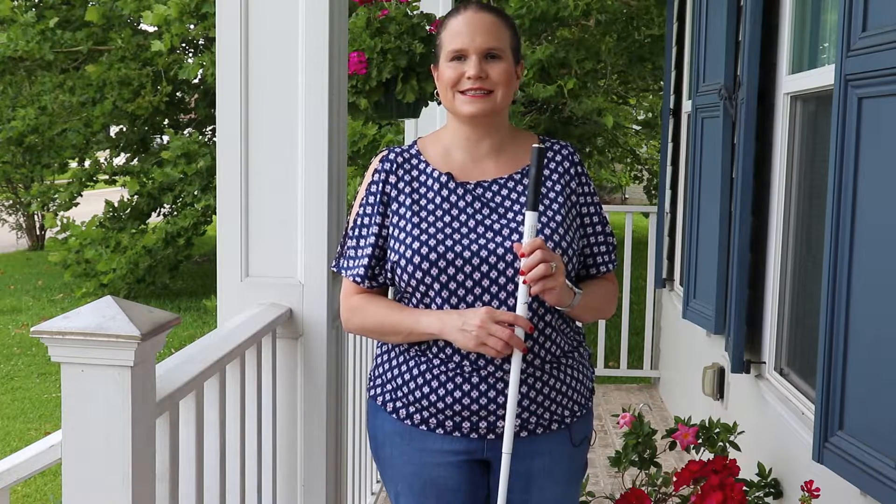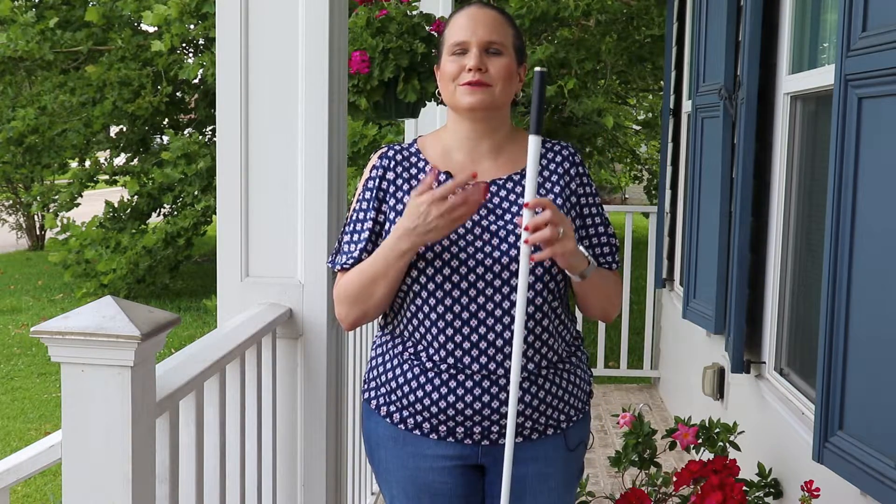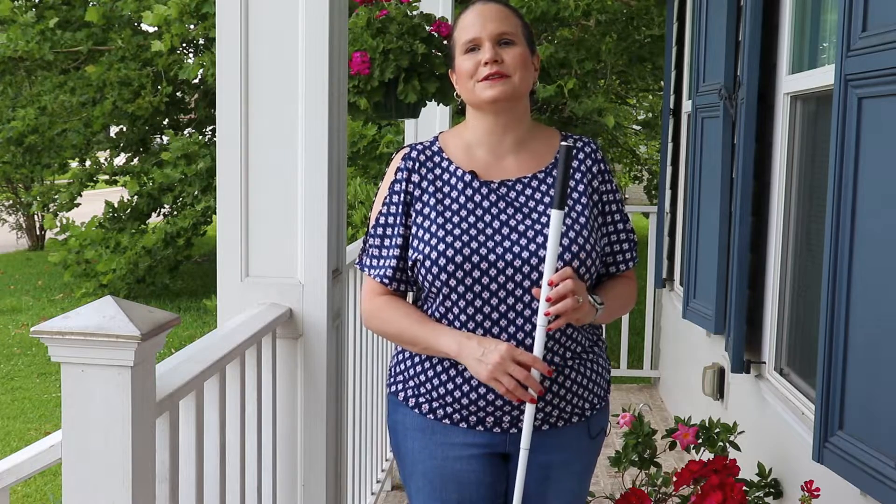Today we're going to talk about the white cane. Between the First and Second World Wars, there was a movement that started in both Europe and the United States to embrace the white stick as a symbolic identifier for blindness. But it wasn't until after World War II where Dr. Hoover with the Veterans Administration recognized the potential of the white stick and transformed it into the long white cane — a tool that blinded veterans could actually use to maneuver safely in their environment. At this point, the stick became the long white cane and the universal symbol for blindness.